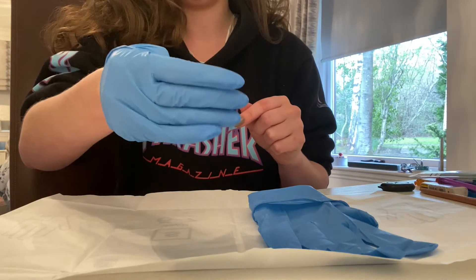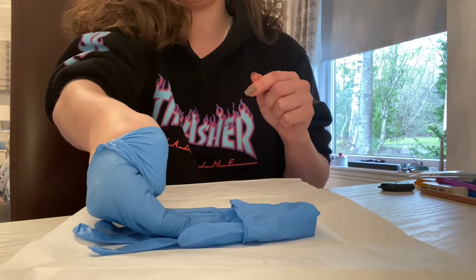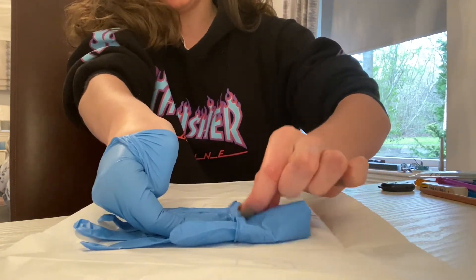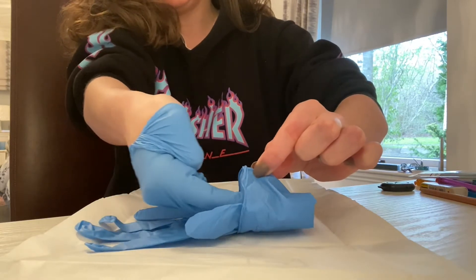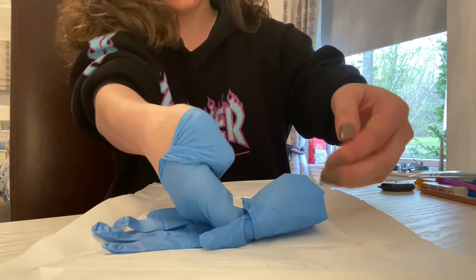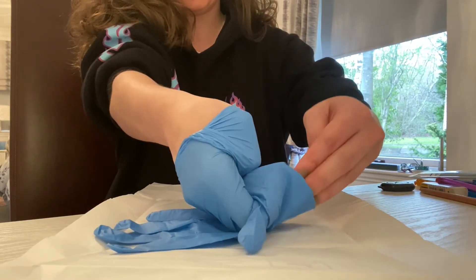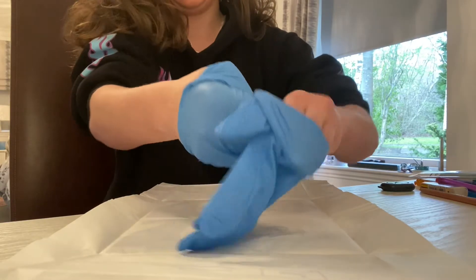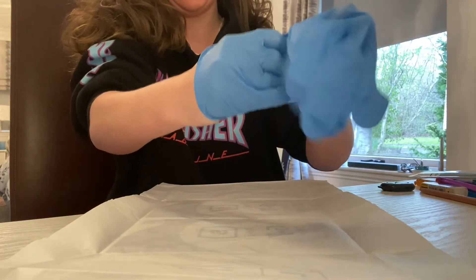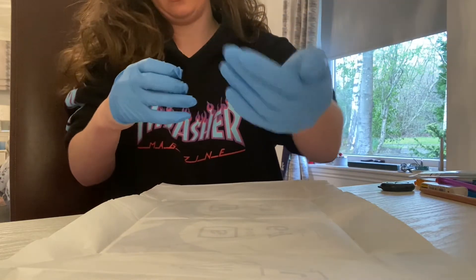I'm going to place these fingers on top of the left glove fingers — I'm just turning it so you can see. I pinch the cuff, sliding my fingers in, sterile surface to sterile surface. Because this thumb is covered, I can touch the matching sides enough to lift and place my left hand in, and that's my left glove on.